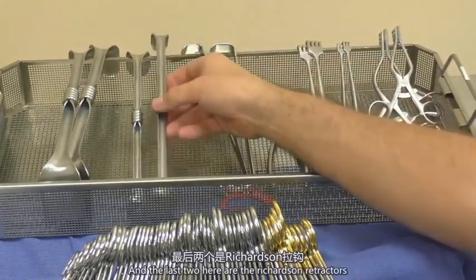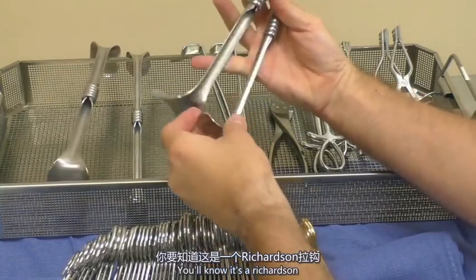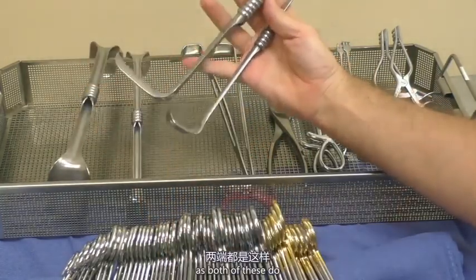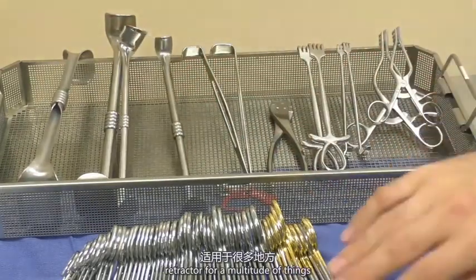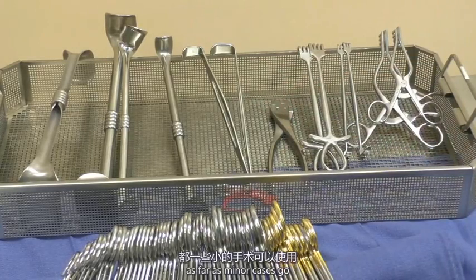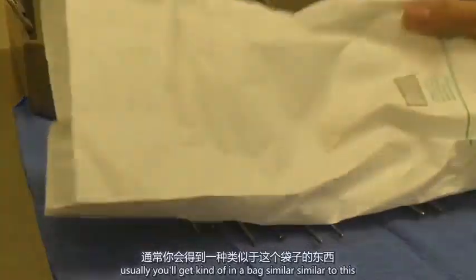And the last 2 here are the Richardson retractors. We got a small one and we've got a big one. You'll know it's a Richardson because it's always going to kind of come back on itself a little bit at the tip, as both of these do. And those are just, again, a good general use retractor for a multitude of things in a multitude of cases across the board as far as minor cases go.